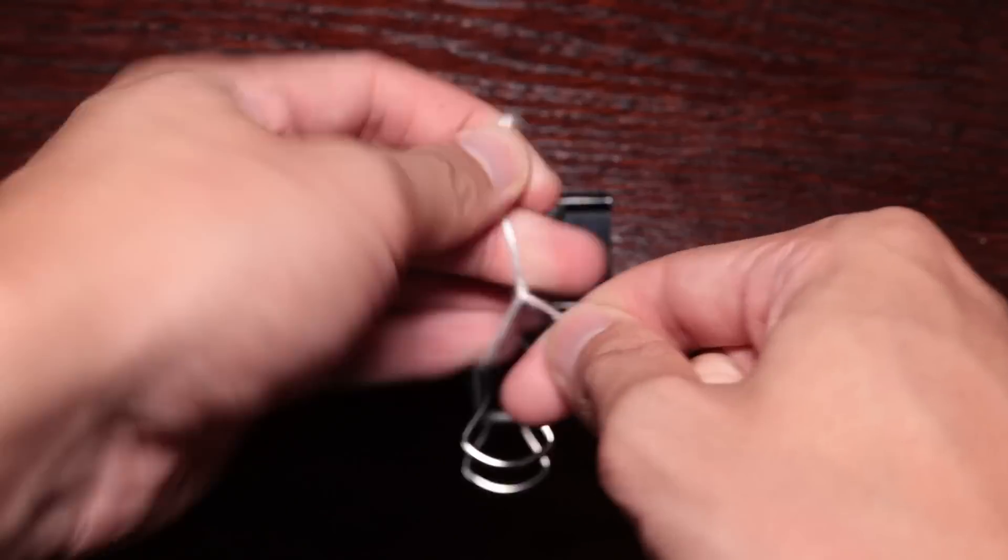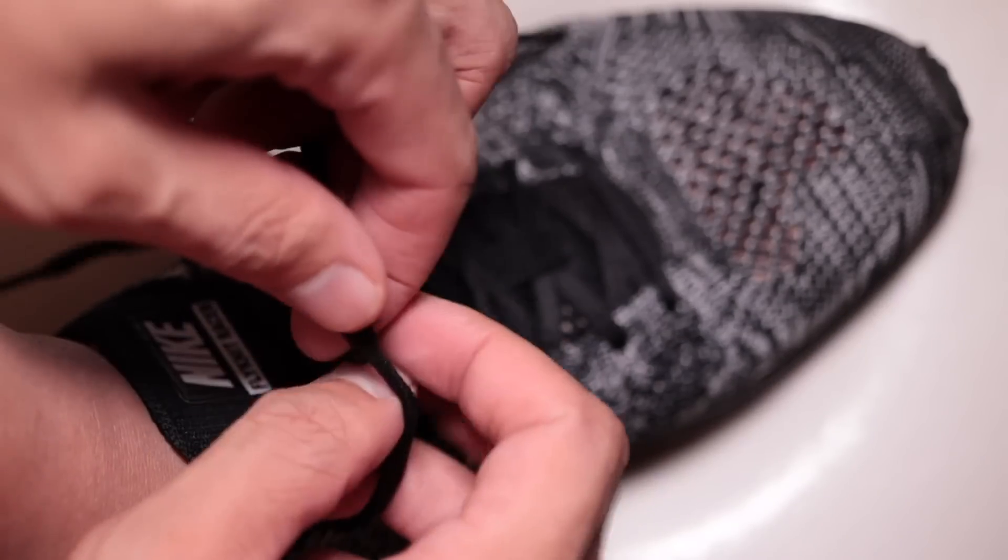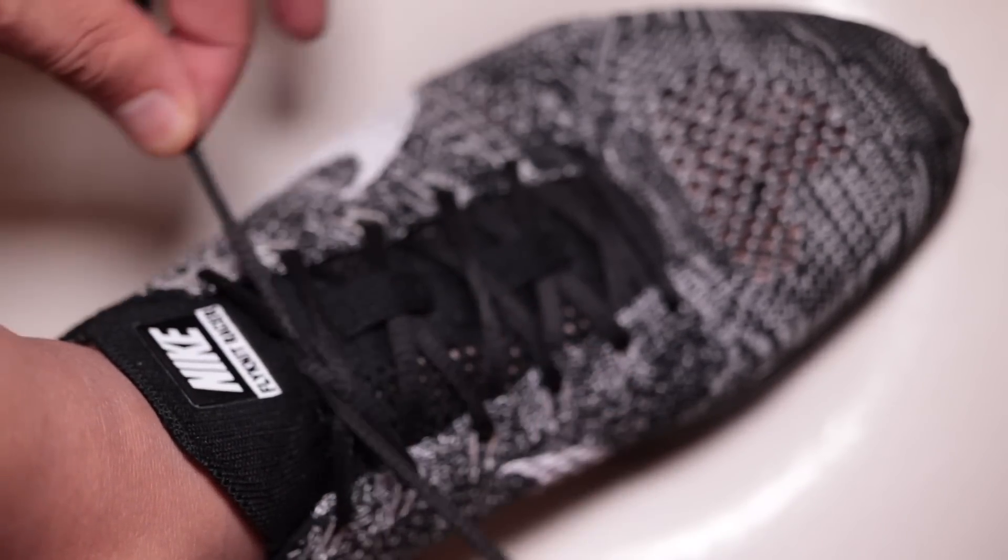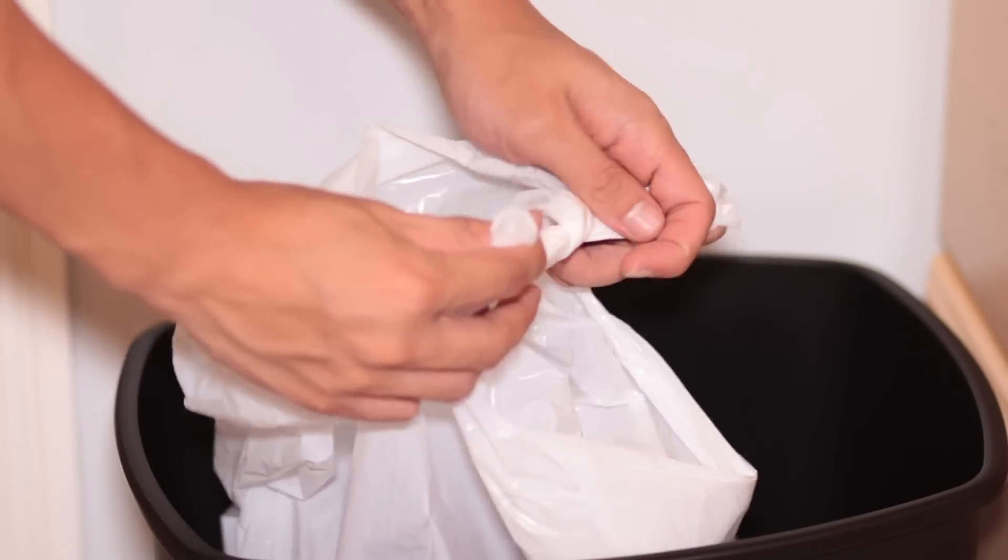The most important thing to keep in mind when tying this knot is that it's not a fancy knot, it's not a sailing knot or figure eight knot. It's really just the same knot you're doing when you're tying your shoelaces or tying up your garbage bags, you're just doing it in a more consistent, fast and secure way. So with that in mind, let's get to the tutorial.